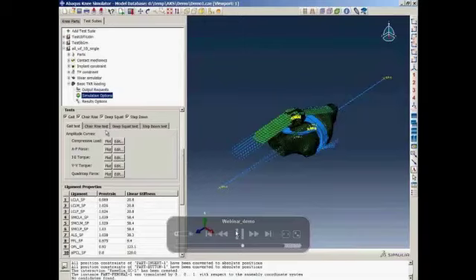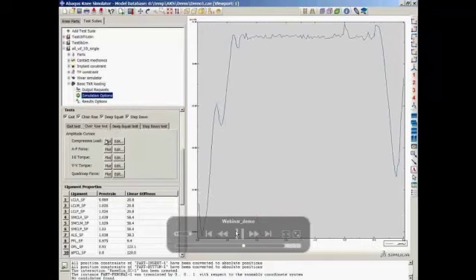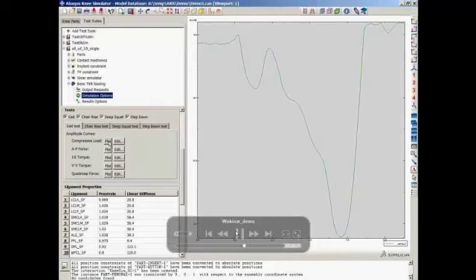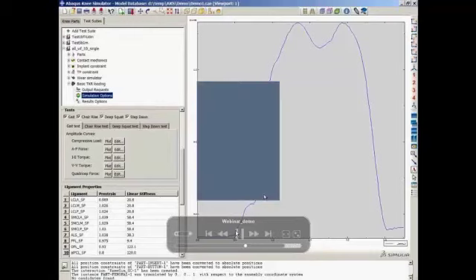the loads are applied as default, and the user can choose to plot these built-in loading conditions, and you can see how different they are from one loading condition to another. And they can also edit these load data using their own either kinematic study or test measurement data needed for this specific activity.